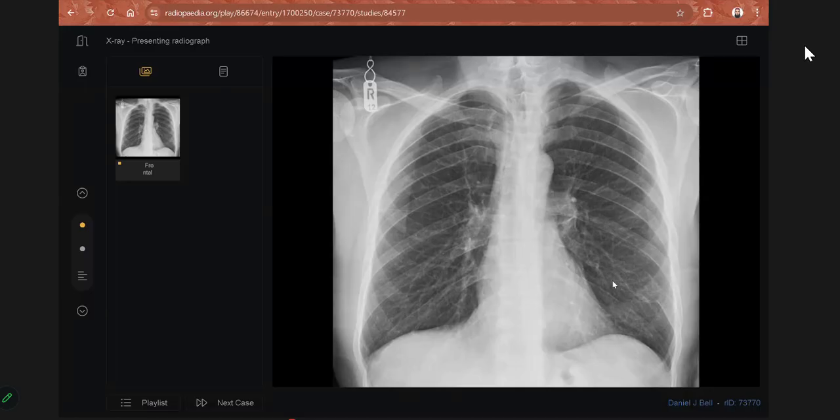If the patient is of old age, then I will think of metastasis as well, and plasmacytoma also will be my differential, or multiple myeloma. You think of mets from which tumor? Mets that appear expansile like this are from renal cell carcinoma and also from the lung, but the lung is clear in this case. So I can think of renal cell carcinoma.